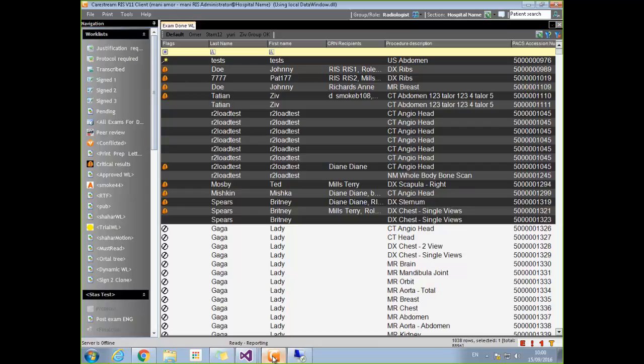Right, but I know, like, with VIP, maybe there is a showing of the name for a particular patient. I'm not familiar with VIP. Yeah, if it's Queen Elizabeth, maybe. Well, the tally's here, I'm sure that'll be tested very shortly. Okay, the VIP is a good point. We may miss it.